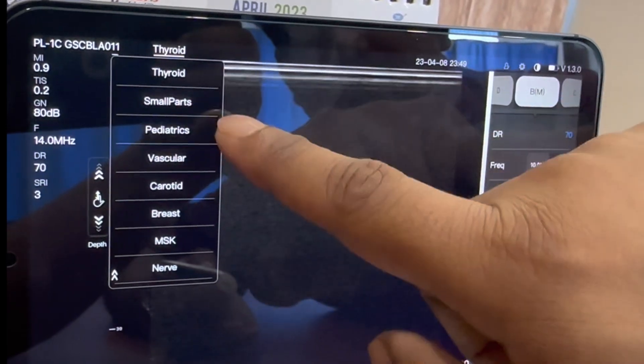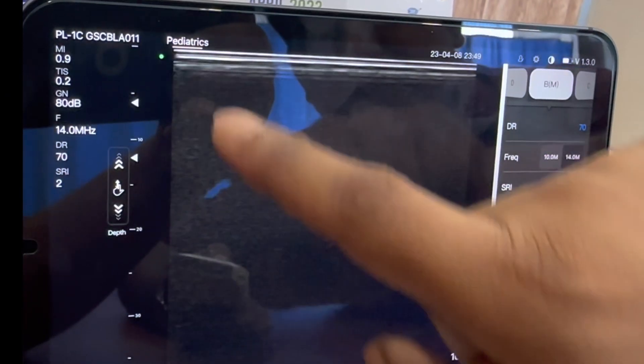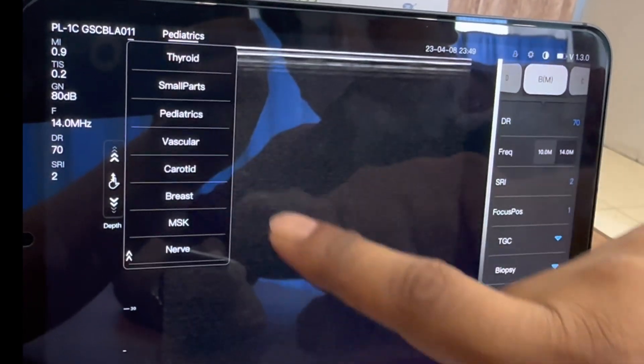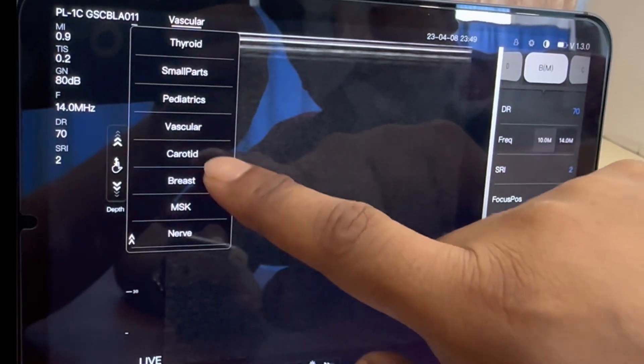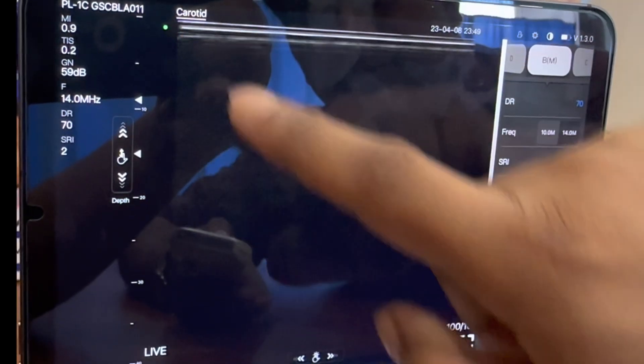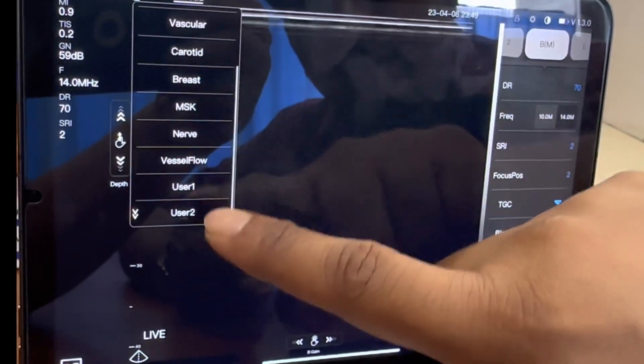Here are some of the preset modes that come with the device: thyroid, small parts, paediatrics, vascular, carotid, breast, and more. By choosing one, the machine will automatically adjust the gain and depth according to the part you select.